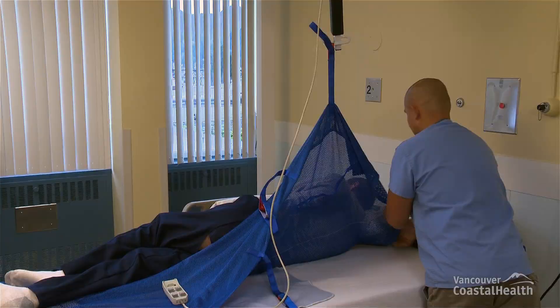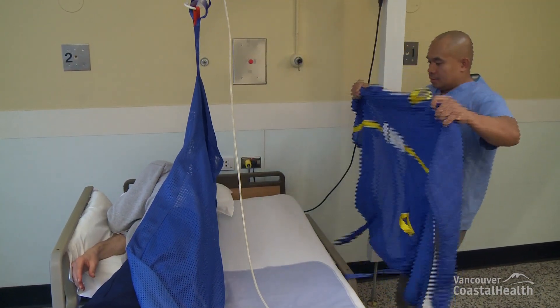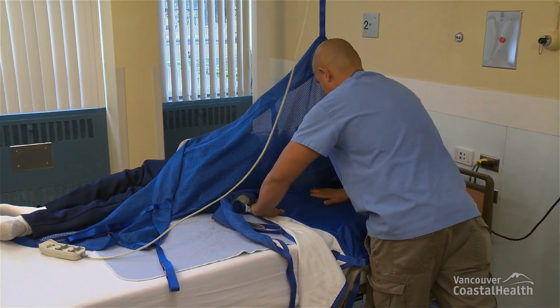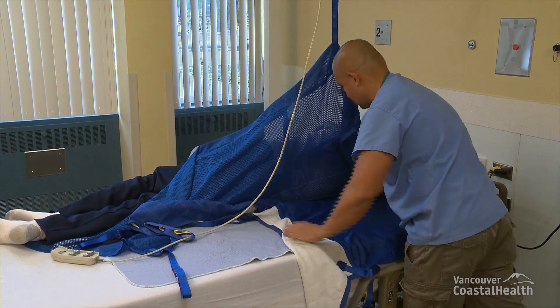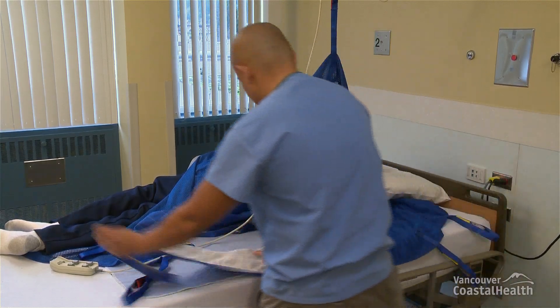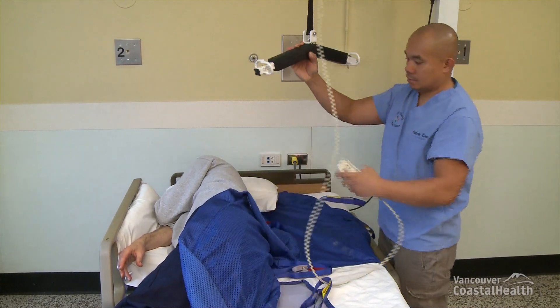Place the transfer sling on top of the bed, ensuring that the sling label and handles are facing the mattress. Align the sling so that the resident's spine is in line with the center of the transfer sling and that the bottom edge of the transfer sling is just slightly above the resident's coccyx. Roll half of the sling and tuck it underneath the resident.